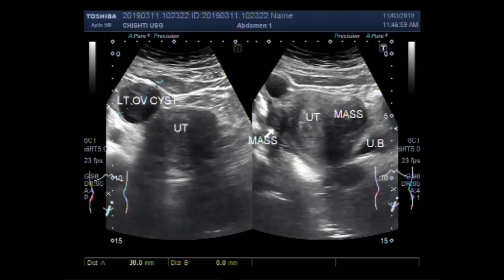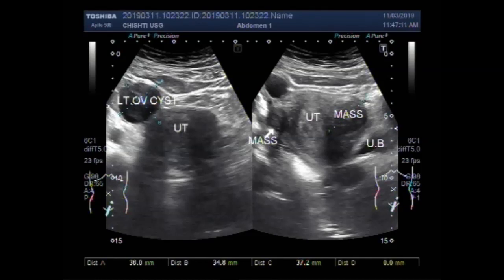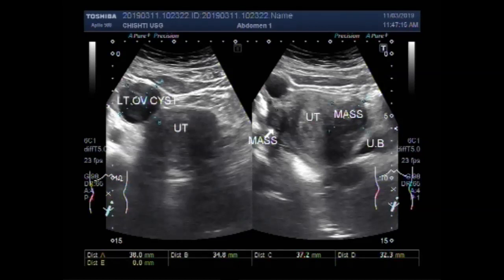Now you see the measurements. The left ovarian cyst measures about 3.8 x 3.5 cm. The larger mass along the anterior wall measures about 3.7 x 3.2 cm. The smaller mass along the posterior wall of the uterus measures about 1.9 x 2.2 cm.